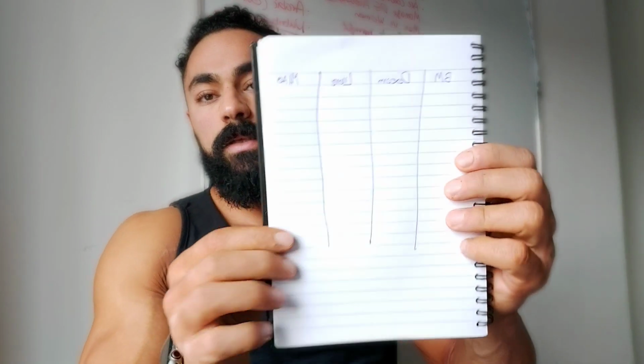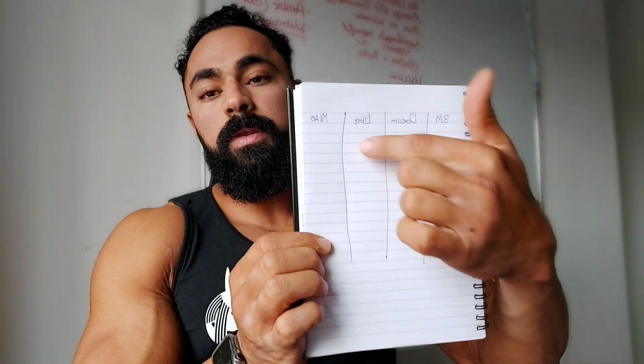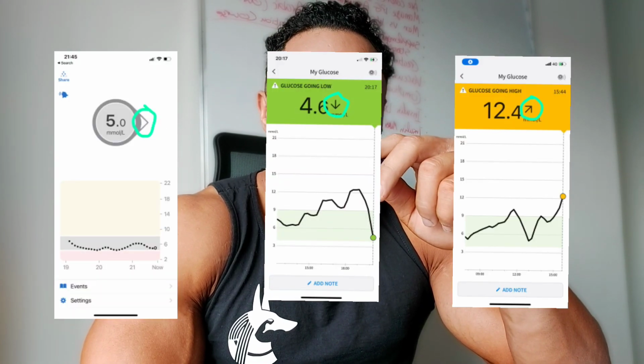Oh, and I have this fancy notebook right here where I'm gonna write down all the measurements that I take, including, and most importantly, the arrows, because as you know, if you check your blood sugar from your blood through finger pricking, it gives you the value from the blood. All the other sensors or techniques, they take it from the interstitial fluid between the skin and the blood. So there will always be a few minutes delay, but the arrows, that you know what I'm talking about, the arrows that dictate whether the blood sugar is gonna elevate or drop, show where it's going.